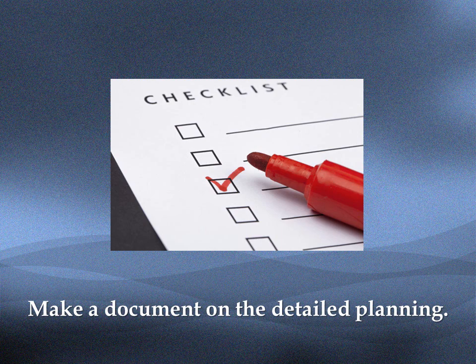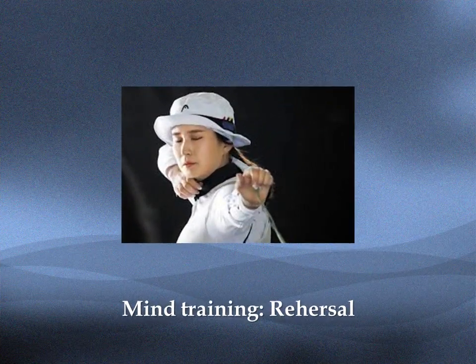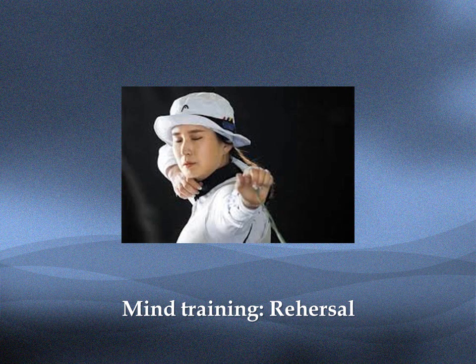And after the ablation, please compare the real procedure with the planning. Define the difference and think what was the reason. One more, the real last step of planning is the mind training, so-called rehearsal.